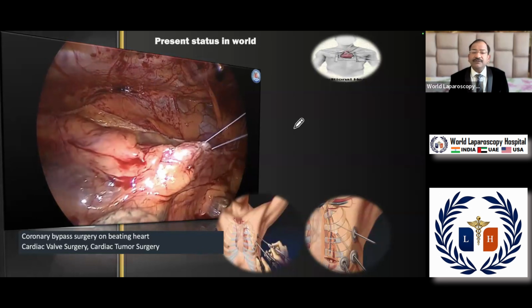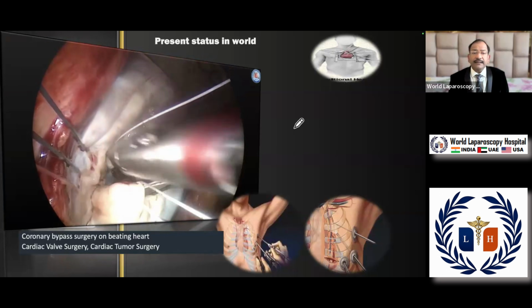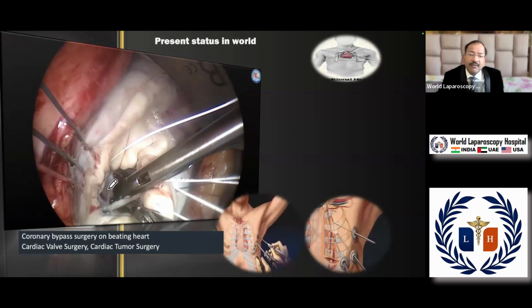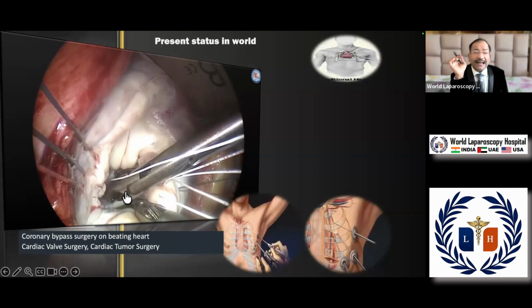and then you can use different types of suture. And after that, here is the Dacron valve. If you see very carefully, the valve is introduced. This is the valve here, and after that you can fix it by the extracorporeal square knot, and you can use the Clark knot pusher. There are different types of knot pushers.